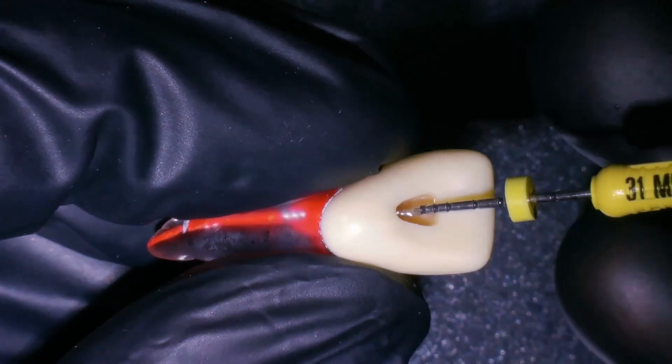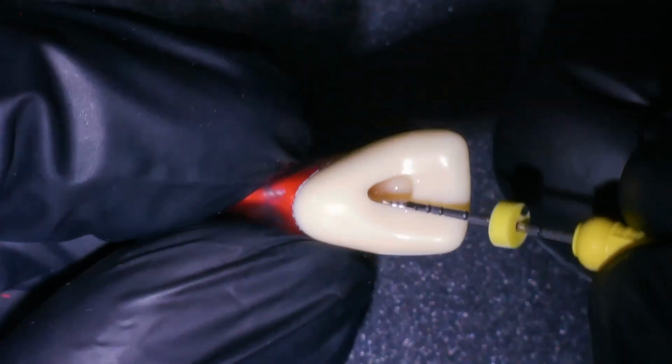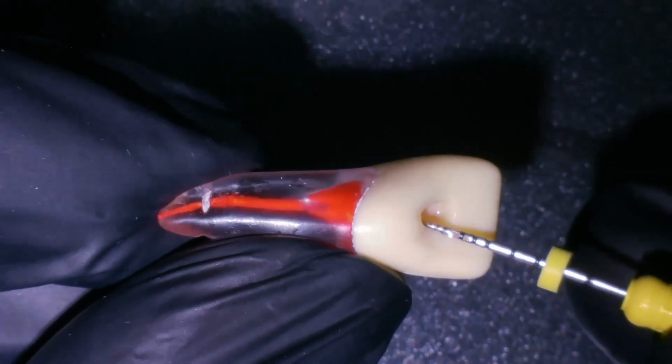Keep in mind that while using indirect vision, the file handle may block your vision of the canal orifice, tempting you to change the file direction, which results in a completely wrong insertion angle. This might lead to canal transportation and ledges.